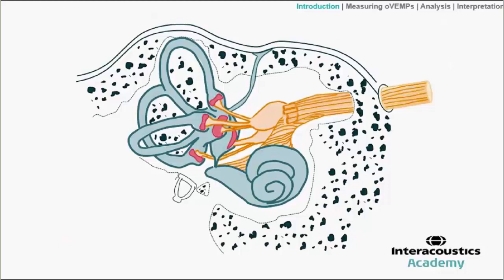But when the sound vibrations reach a certain intensity, then they have enough energy to overcome the higher fluid impedance of the vestibule, and then they can be used to trigger vestibular activation.